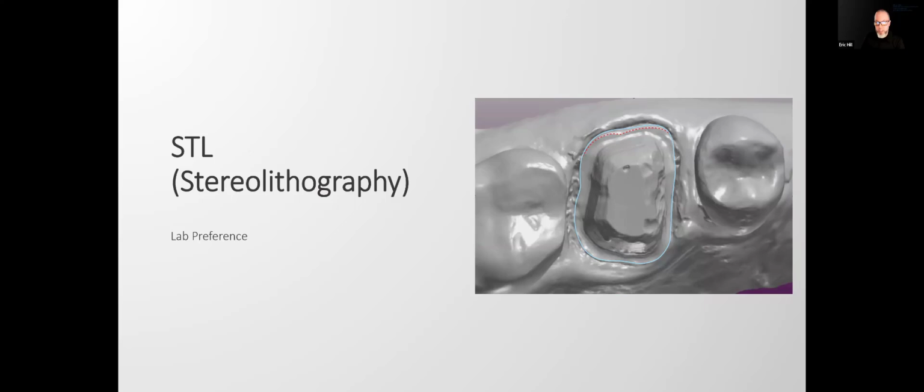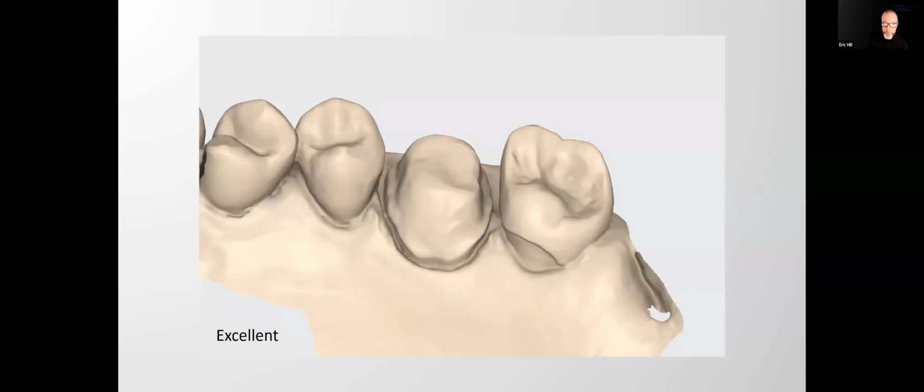And if you can see the margin clearly in STL format without having to rely on color, generally you're going to get a good result there. So make sure you're toggling back and forth, if your scanning software has that, of course, which most should, between the STL and the PLY to make sure you can see the margin clearly on both of those scans.